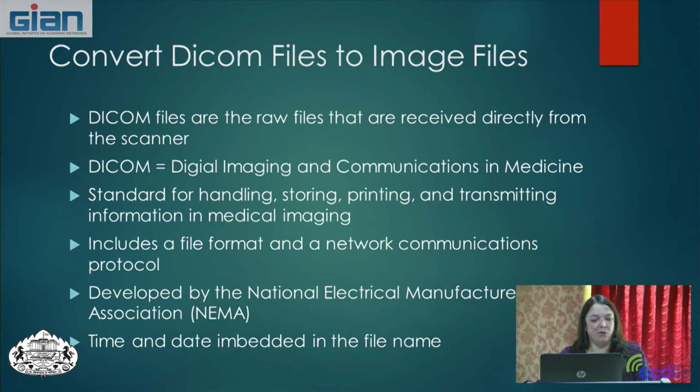Okay, so the DICOM files include a file format and a network communications protocol. It's a little bit over my head, but that's what they claim is in these, and it was developed by the National Electrical Manufacturers Association. And like I mentioned, the time and the date are embedded in each of these files, and by the time, I mean time down to the milliseconds is recorded in these.